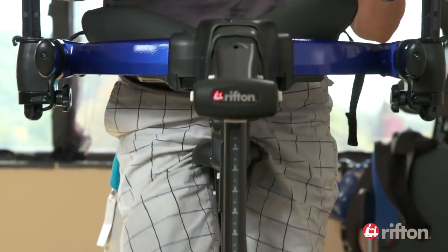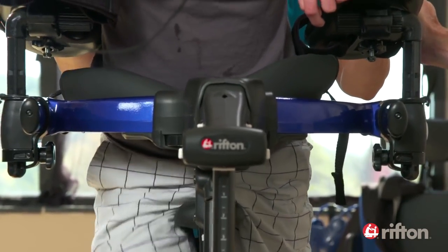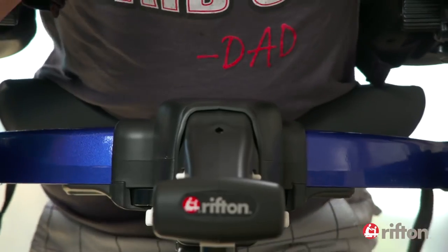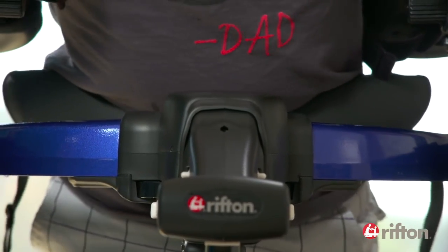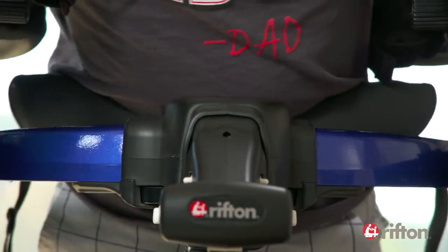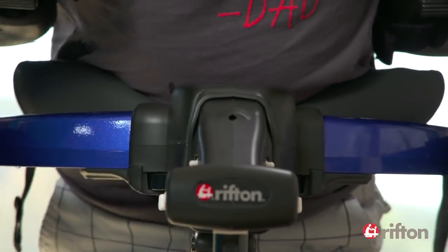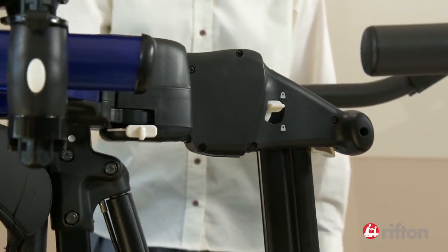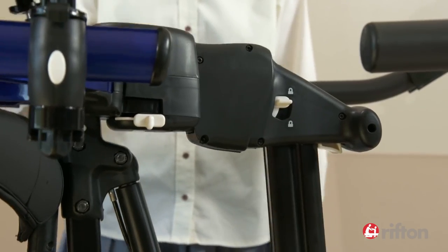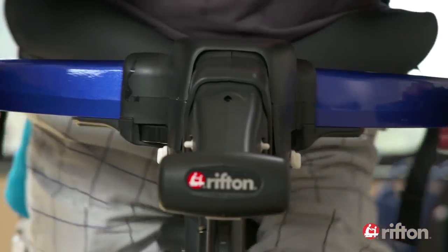Note how the dynamic feature on the upper frame encourages a more natural gait pattern and easier stepping for Scott. We anticipated that the moving belt would be a new and different experience for Scott. Without the support of the pacer, it would be very difficult to do this kind of gait therapy safely. The side-to-side movement allows for up to 2 inches of horizontal movement. This lateral freedom allows Scott to shift his weight from one limb to the other.